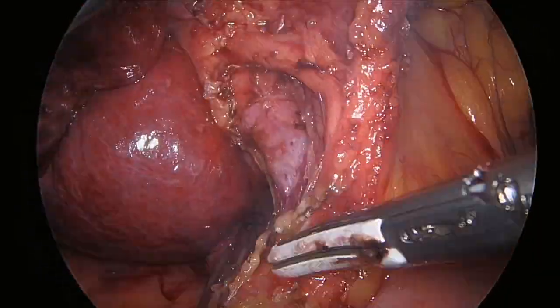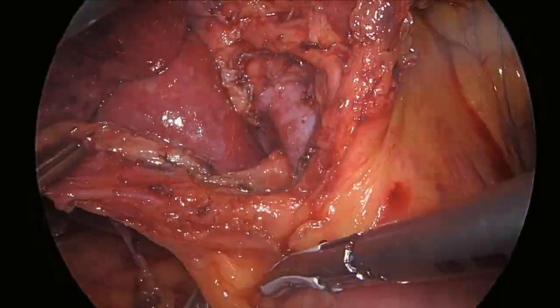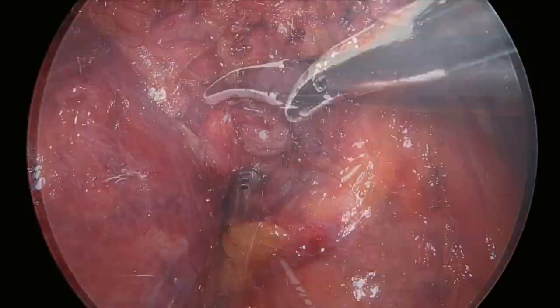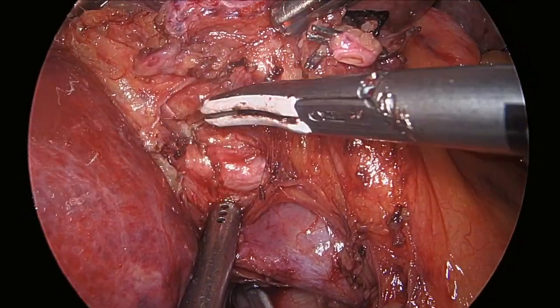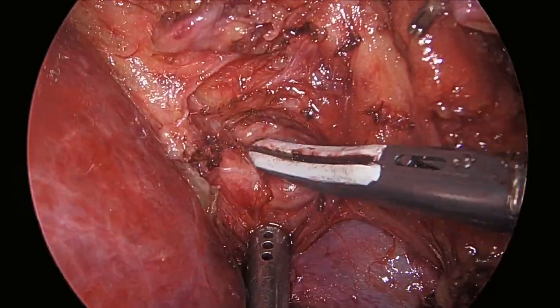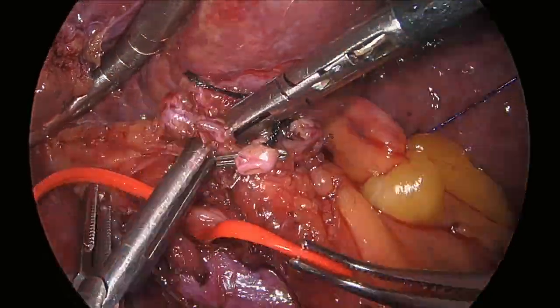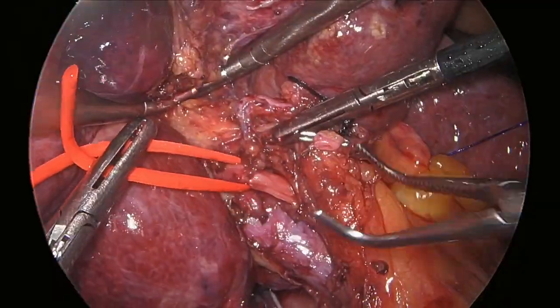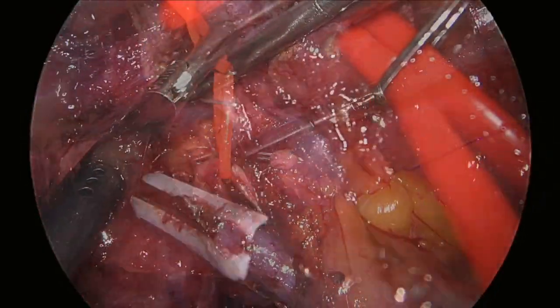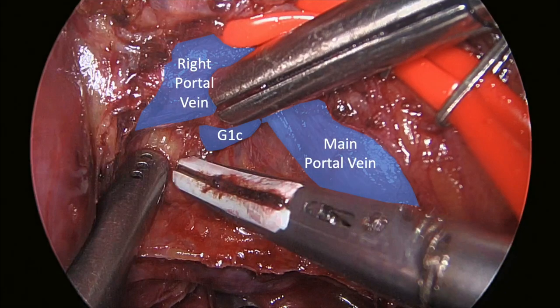We can then identify and remove the 12b and 12p lymph nodes to expose the main portal vein. With the cystic duct retracted medially, we then work to expose and isolate the right hepatic artery as it courses posteriorly to the common bile duct. With the right hepatic artery now isolated, we can retract this medially to identify the right portal vein and the caudate branch, or G1C.